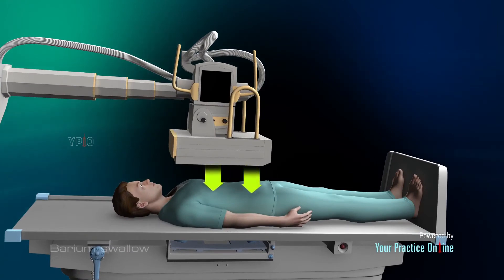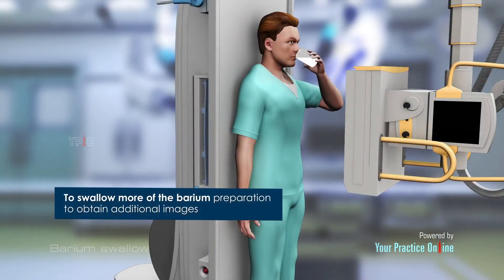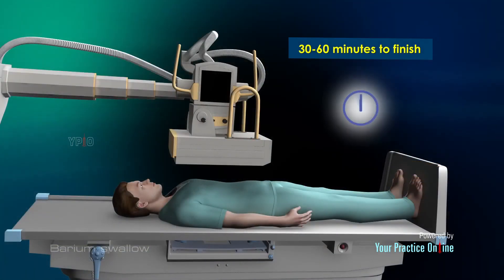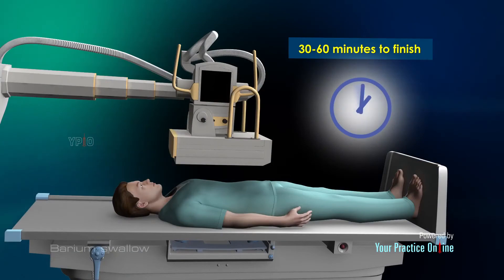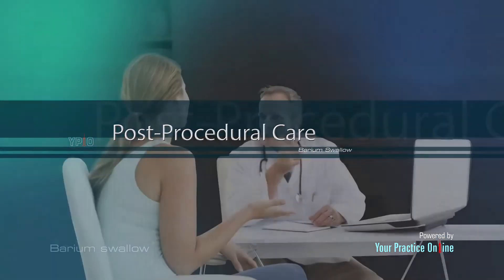Your doctor may apply pressure to the abdomen to spread the barium inside. You will be asked to swallow more of the barium preparation to obtain additional images. The barium swallow procedure takes about 30 to 60 minutes to finish.